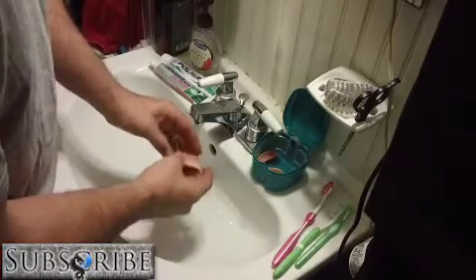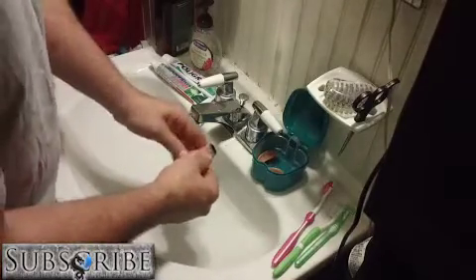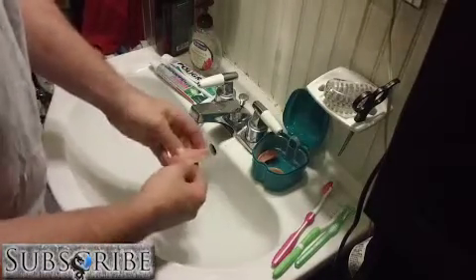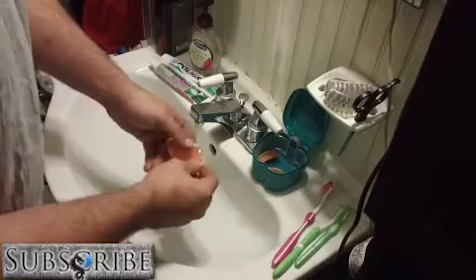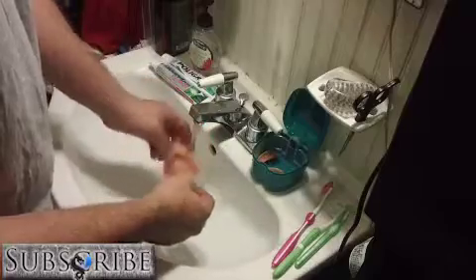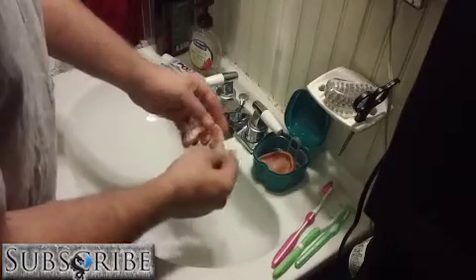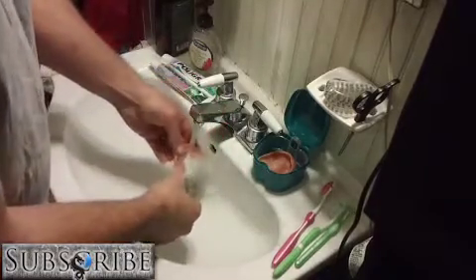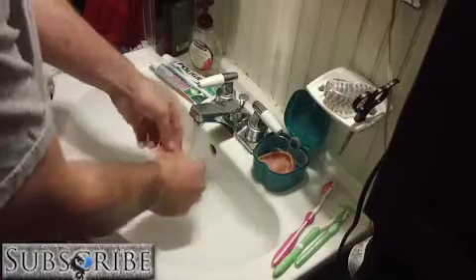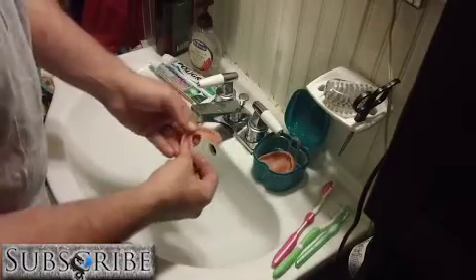Now I also brushed and polished these. I usually don't, but I did last night. I just used regular non-abrasive toothpaste and a toothbrush, and then I soaked them. And the same with the lowers. So I polish these guys a little bit, and I'll do it every now and then, probably every other week or once a week. And here's the thick spot that I was showing you earlier.